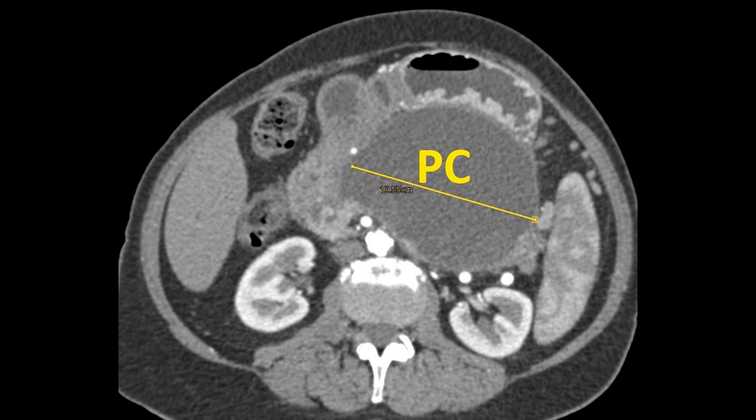Here's a classic pseudocyst — note the circumscribed wall, homogeneous attenuation, and extrinsic mass effect upon the pancreas with the tail displaced posteriorly.